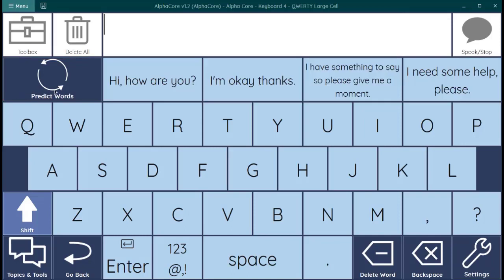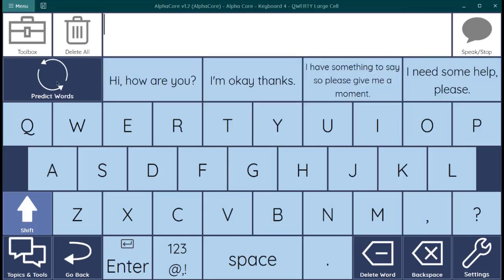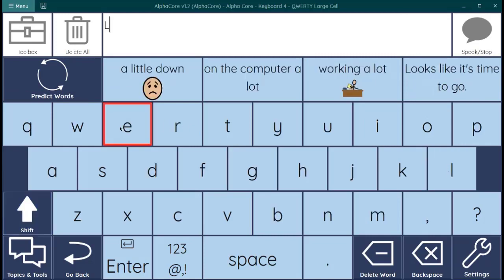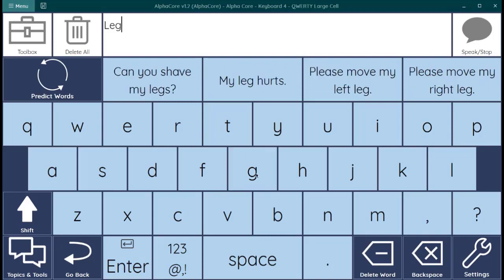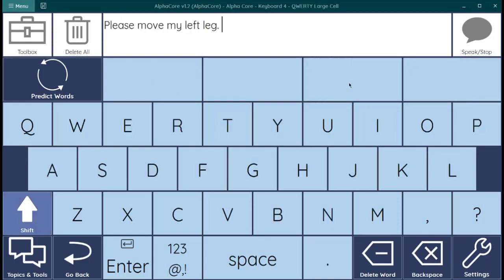So, here you can go between word prediction and sentence prediction. This is so we can make the buttons bigger on this keyboard. Now, a fun trick with sentence prediction is you can use a keyword. Let's try this one. We'll type the word leg. When you do that, the sentences that are frequent sentences that have that word in them will appear. So, you could say, please move my left leg.